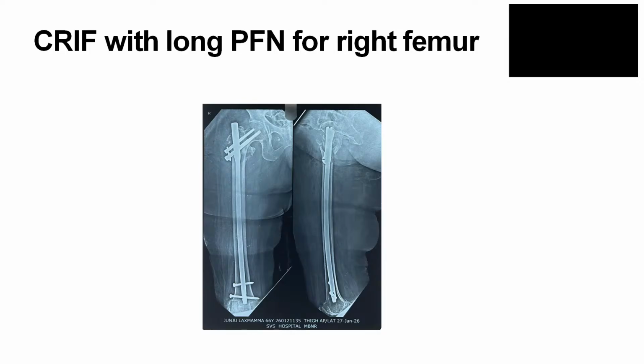To hold this, we prevent the proximal migration to give better stability, and even for removal also to some extent. It prevents the Z effect. The Z effect can be reverse Z effect and Z effect. The Z effect comes into play when there is improper reduction, improper fixation and improper selection of the case. To avoid this they are using the InterTAN, which is a more biomechanically stable construct. There is a newer generation to prevent the reverse Z effect and Z effect phenomena.